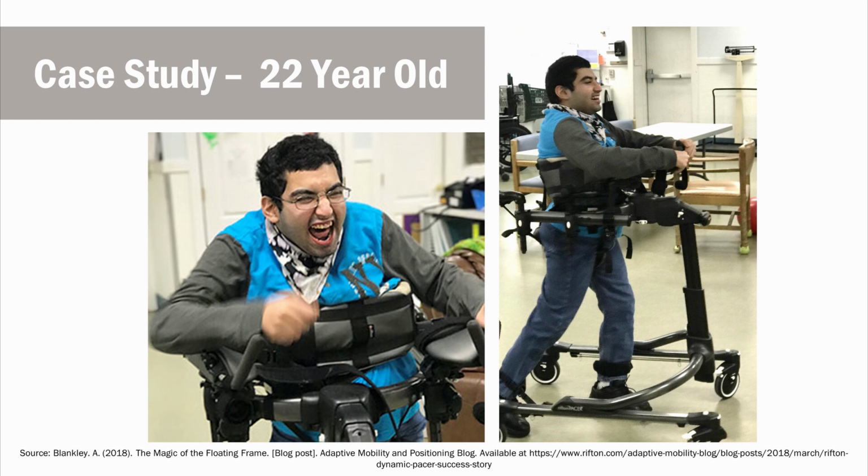And we'll close with our final case story. This is Seth. He is a 22-year-old, just graduated from his school system and transitioned to an adult services program. He does have cerebral palsy and developmental disability with a history of leg surgery and came to the program in a wheelchair. The program started him out in a standard rigid gait trainer, but he had some difficulty with navigating himself out of corners or around furniture and often required help.